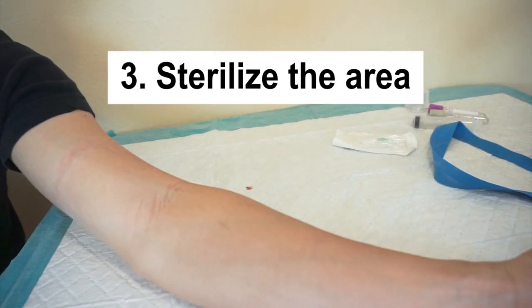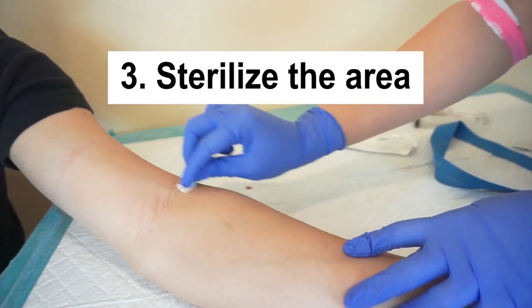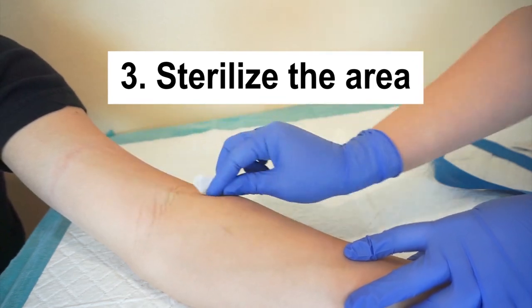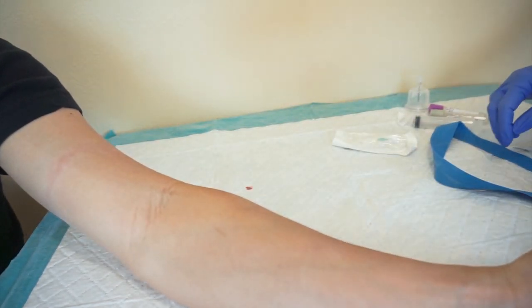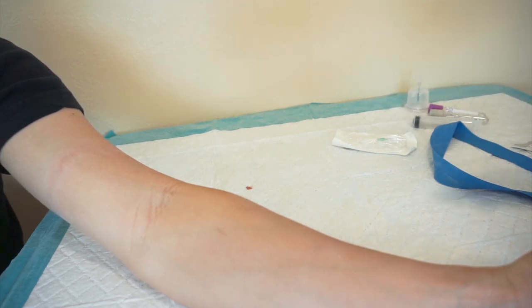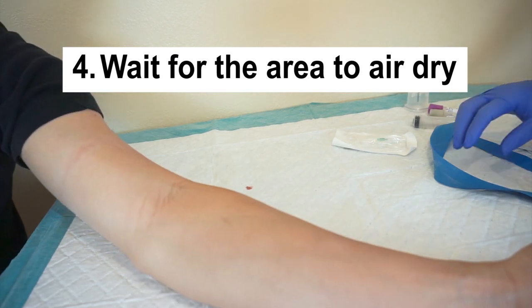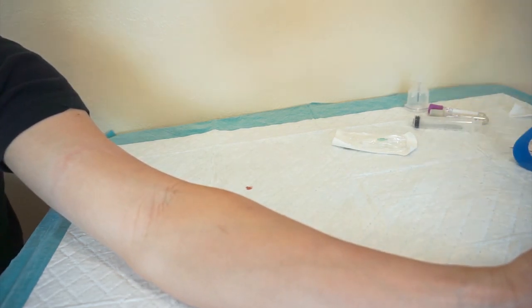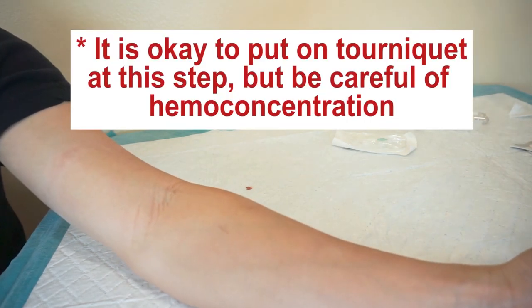Third, sterilize the area by using an alcohol pad in circular motions from inside to outside. Note that if the patient is here for a blood alcohol level, do not use an alcohol pad. Other agents that can be used are chlorhexidine prep and iodine. Fourth, wait for the area to dry before puncturing the vein. Do not blow or wave because you will reintroduce bacteria to the draw site.